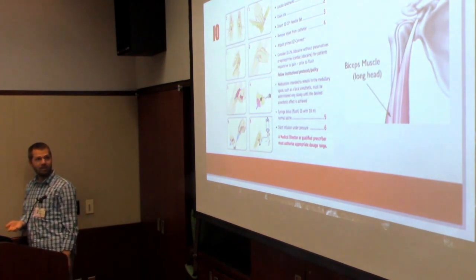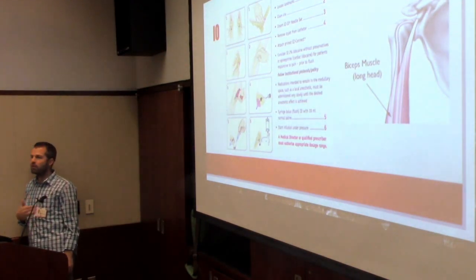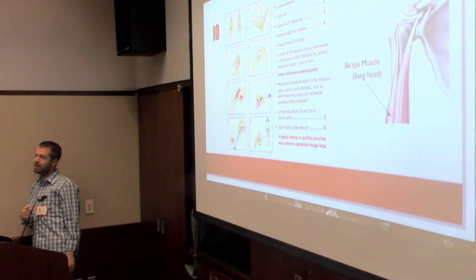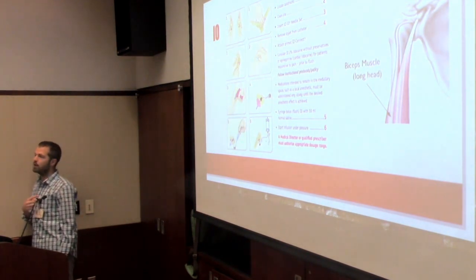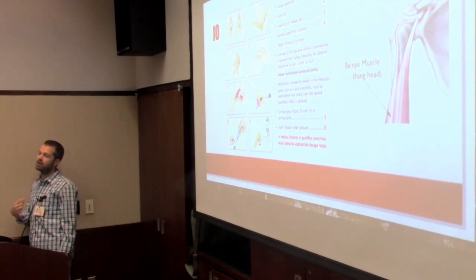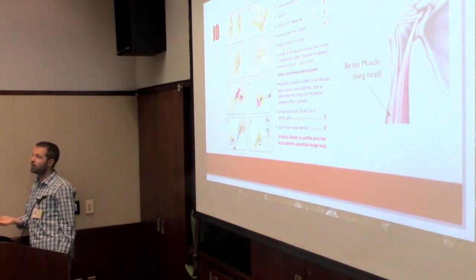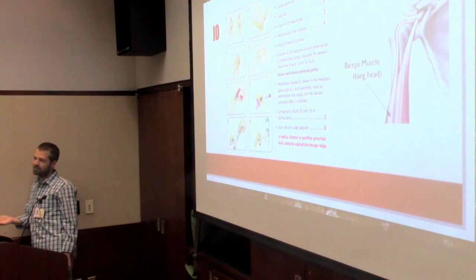Like, did I sever somebody's biceps tendon? I don't know. I probably wasn't thinking when I was putting it in. But that's just one of the things you can think about. So for every procedure, review what anatomical things matter. You don't have to know every piece of anatomy, but that seems like a pretty important thing to know that no one ever told me. So for any procedure you're gonna do, think about the contraindications and think about the anatomy you're really trying to miss. Some things are obvious. Sticking a needle in your neck, there's probably a few things in there I want to avoid, right? But there may be other access points where there are other things you're trying to avoid.